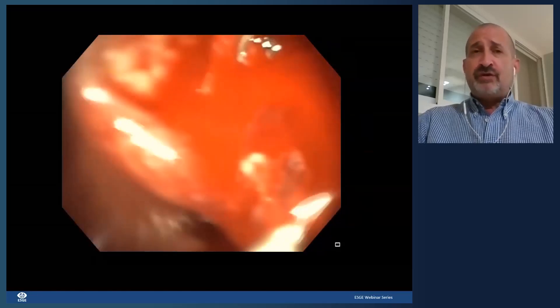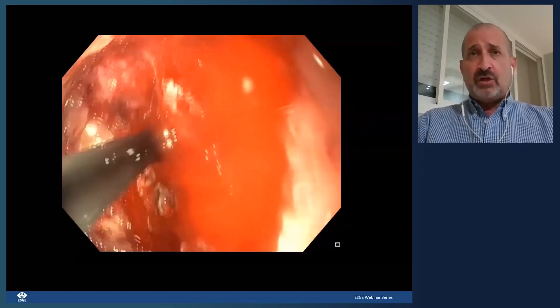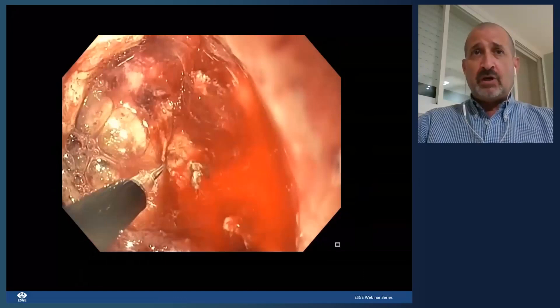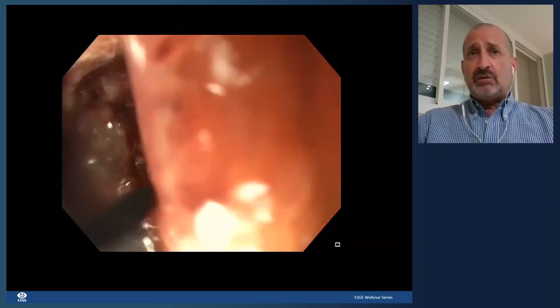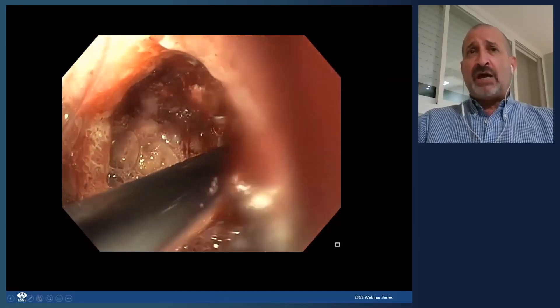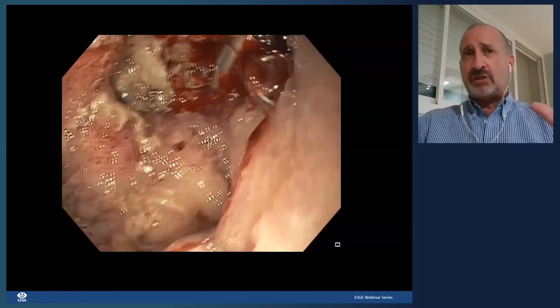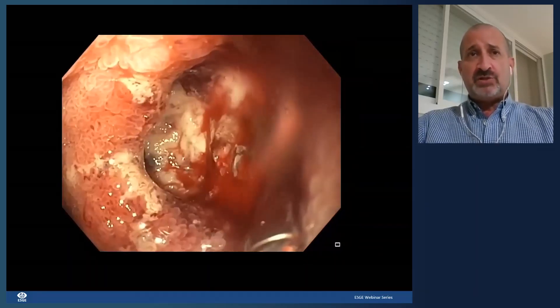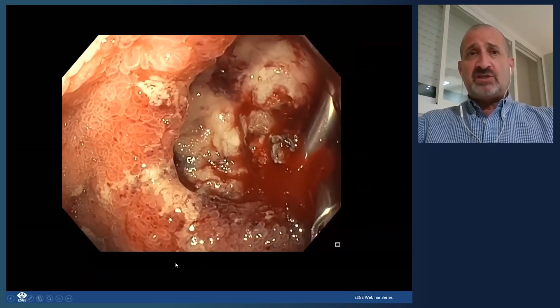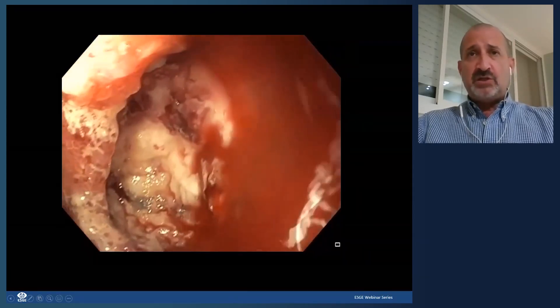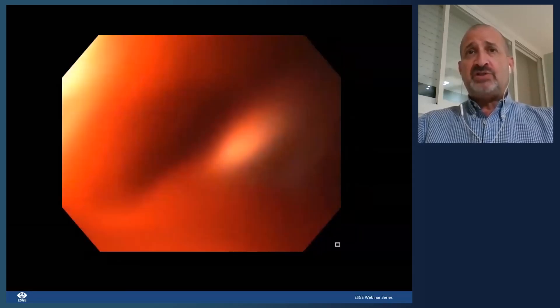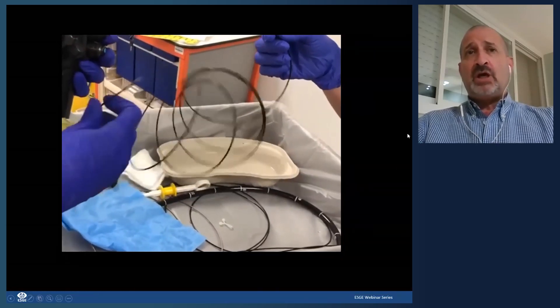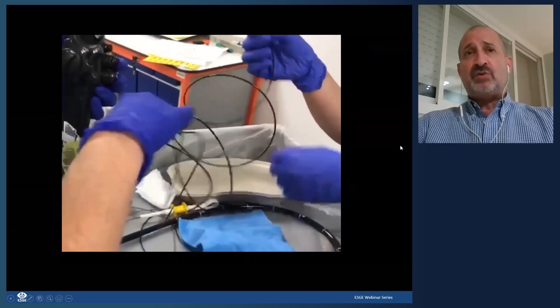This case from my colleague Dr. Marine Camus shows a duodenal ulceration that continued to bleed despite through-the-scope clips. Epinephrine was injected but there's still active bleeding. This is a large fibrotic lesion — the type where you really want to consider using a cap-mounted clip.